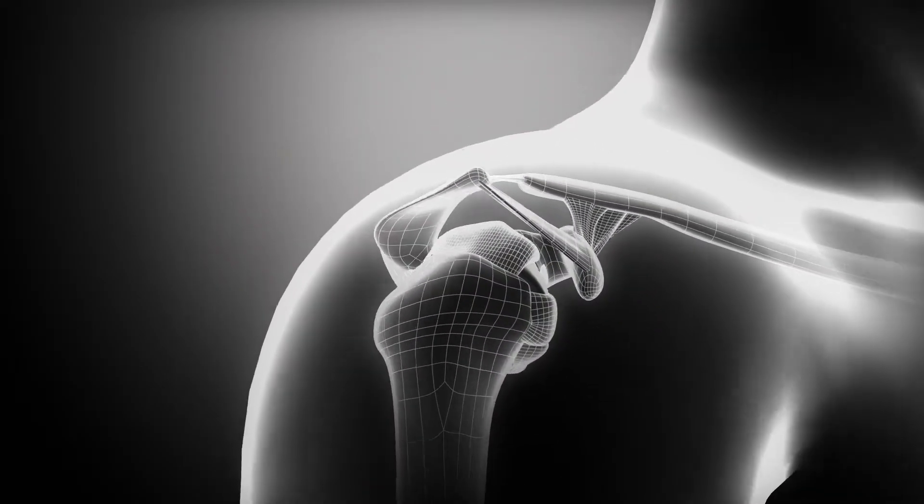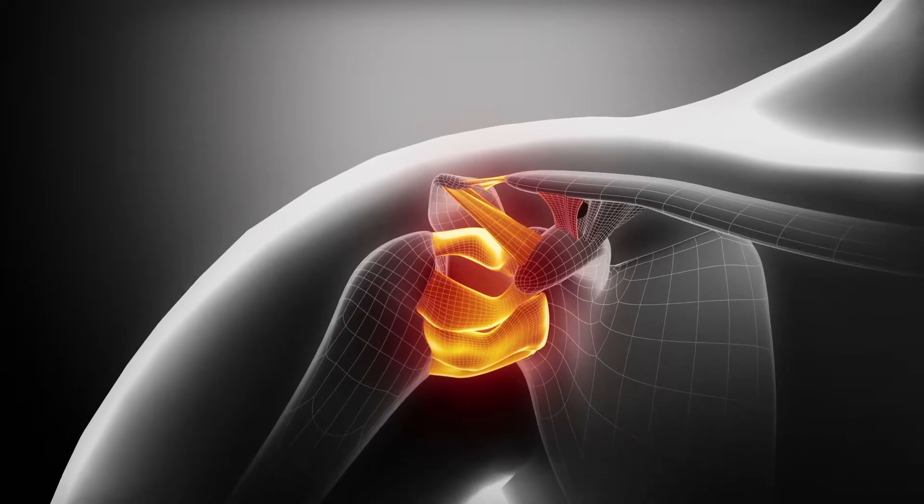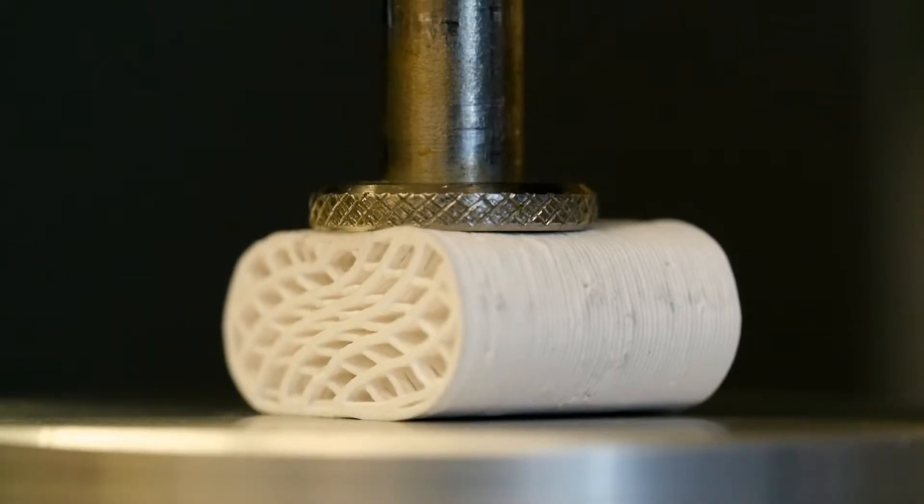But what if Dr. Shah could have ordered up a 3D printed shoulder, customized to spec just for her? What Rommel and Adam have done is they've created something very unique, very innovative, and a game changer in many aspects. In essence, they've created a synthetic bone.